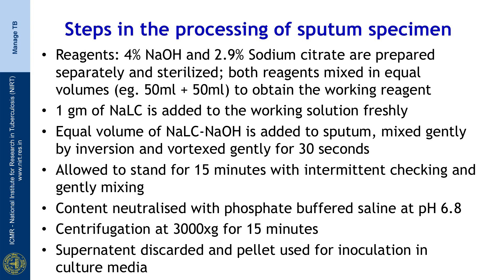1 gram of sodium N-acetyl-L-cysteine is added to the working solution freshly. An equal volume of NALC-NaOH is added to the sputum, mixed gently by inversion and vortexed gently for 30 seconds, then allowed to stand for 15 minutes with intermittent checking and gentle mixing. The content is neutralized with phosphate buffered saline at pH 6.8, then centrifuged at 3000 g for 15 minutes. The supernatant is discarded and the pellet is used for inoculation in culture medium.